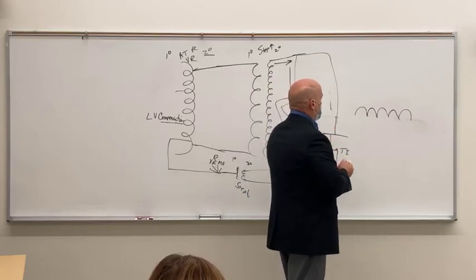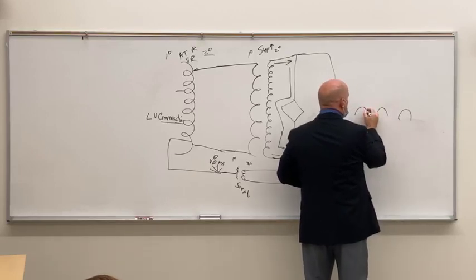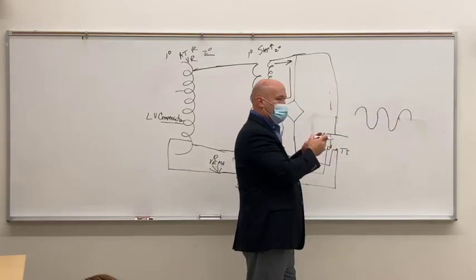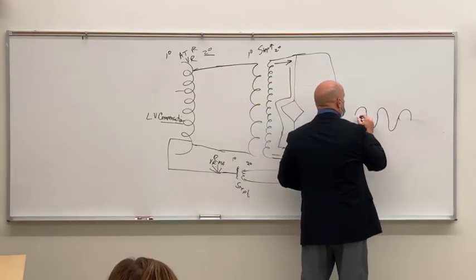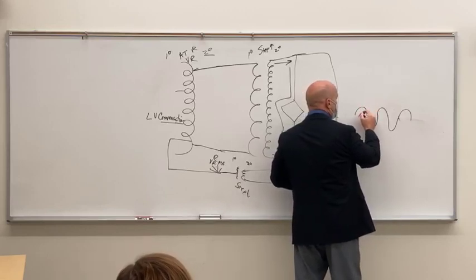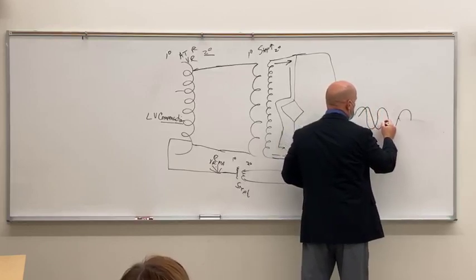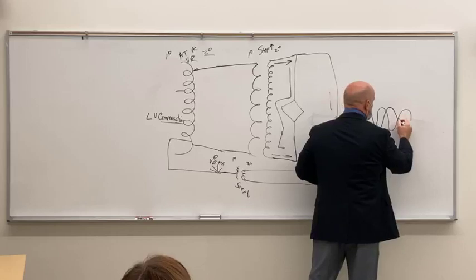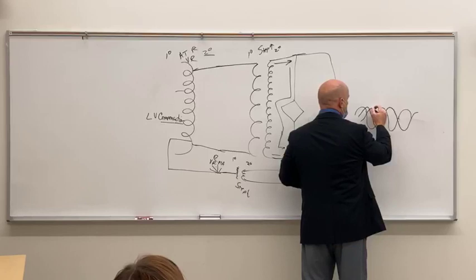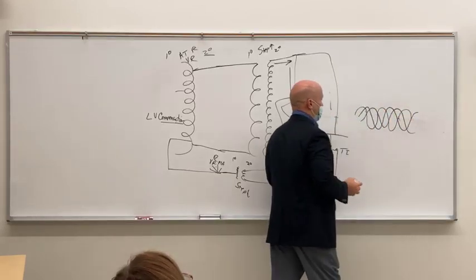But once it gets to rectification, let's take it all the way back to half wave. If we've got three pulses that overlap, but they stagger, then what we're going to have is a pulse that starts, and whenever it reaches its peak and starts to come back down, we send in another pulse. This is so much harder to draw than you might think. So we've got two pulses that overlap, and whenever that one starts on its down cycle, we send another pulse in, and they look like that, okay?